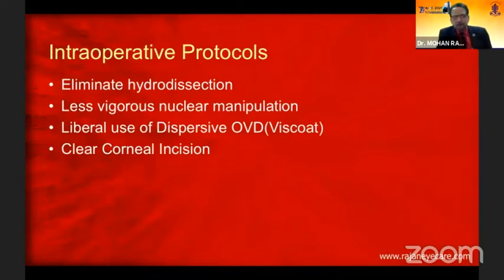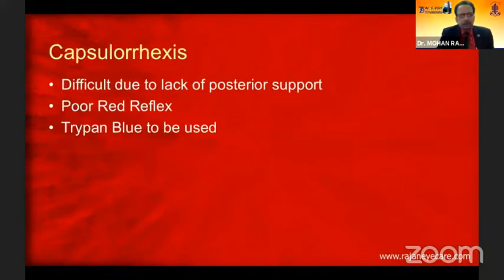Intraoperative protocols: please eliminate hydrodissection, or be careful in not doing hydrodissection, less vigorous nucleus manipulation, liberal use of dispersive OVD. I don't have any financial interest. Viscoat is probably the way to go. Clear corneal incision is the way to go.